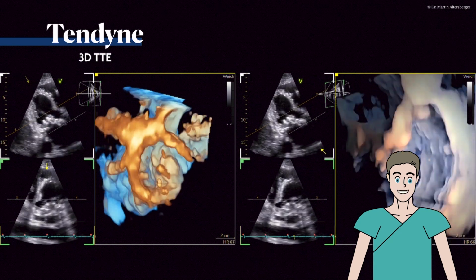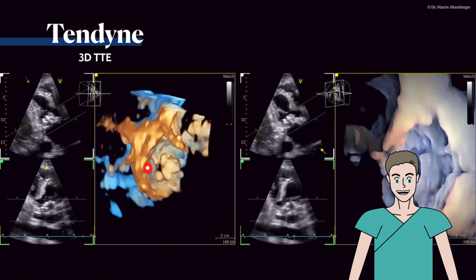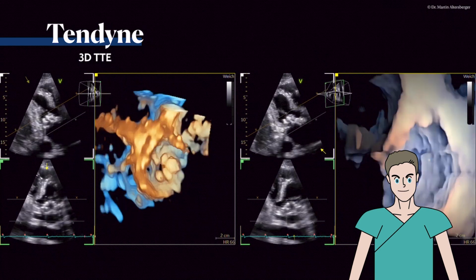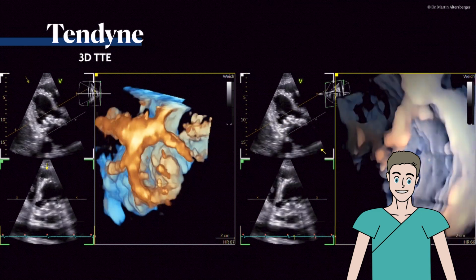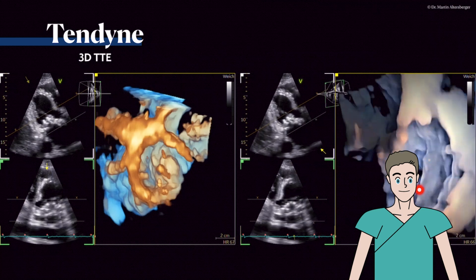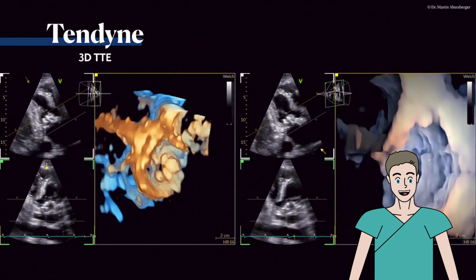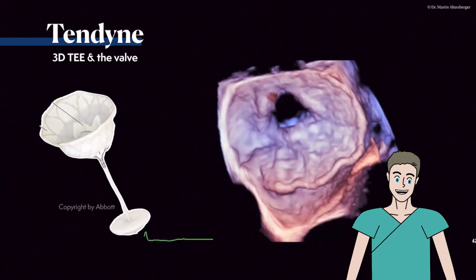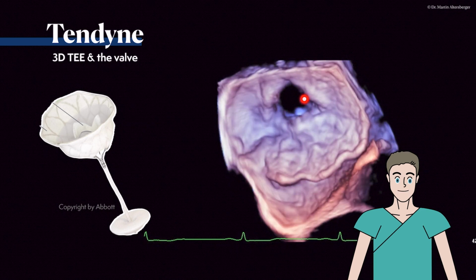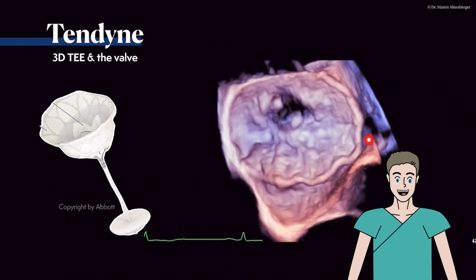From the top we see here the opening and this umbrella-like structure, and here we are looking from below towards the valve, and we see with this special light, the FlexiLight, this umbrella-like structure, and here the opening of the mitral valve. In a TEE study you can even see it more clearly. Here's the valve. The valve is opening in this large umbrella.